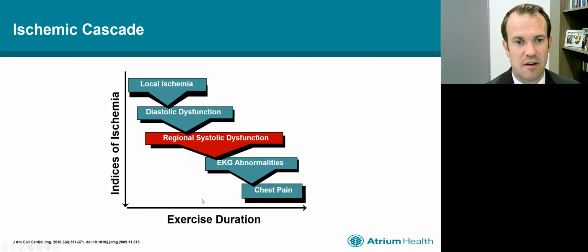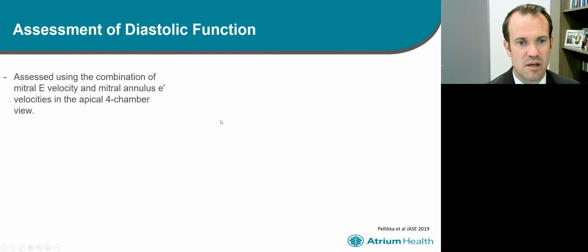And remember, as we think of the ischemic cascade, as exercise duration goes on, we'll get local ischemia, and diastolic function will precede regional systolic function, which will occur before ECG abnormalities or chest pain. So assessing diastolic function can be very useful.